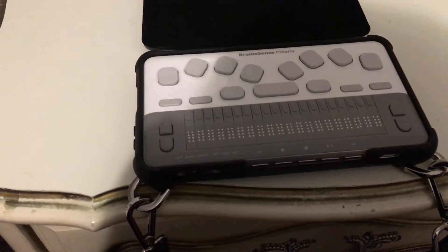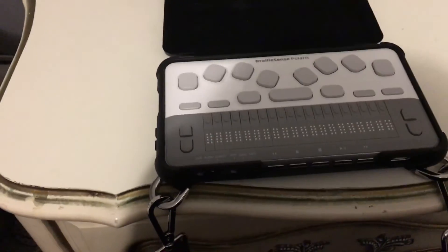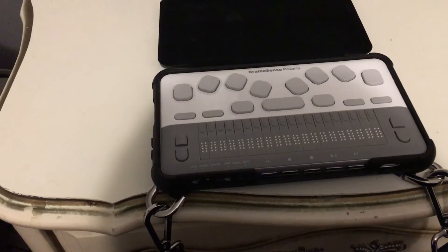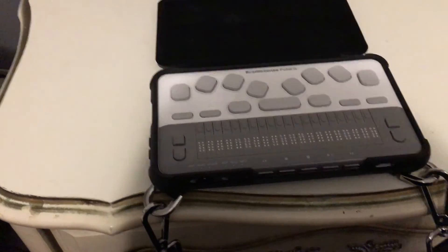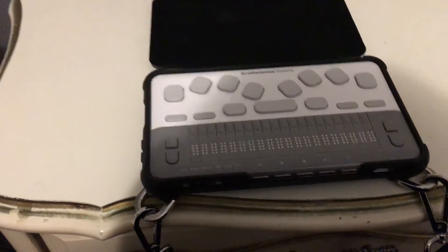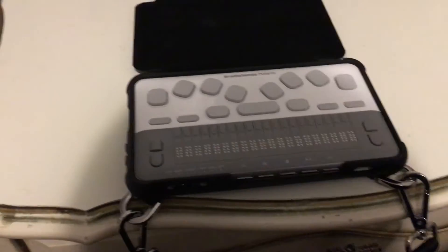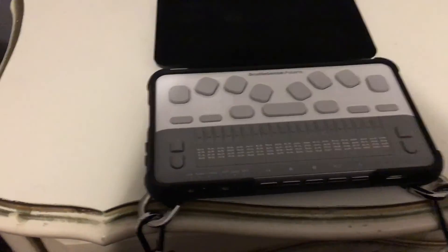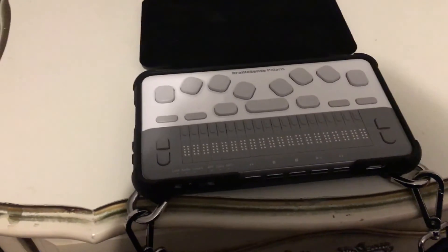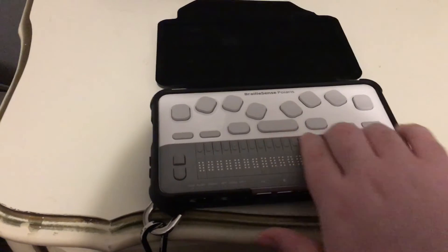So that is a tour of the Polaris Mini. If people would like, I'm happy to do some comparisons between the BrailleNote Touch and the Polaris, because they're both close competitors and it can be tough to decide which one to get. Both have their strengths and weaknesses. If there are certain tasks you want to see each one do, let me know in the comments. I also intend to make more tutorials on each unit, and I'm going to do a full series on the Polaris Mini.